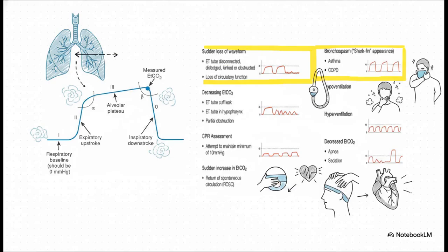Let's apply this to another case study. Your intubated patient suddenly triggers an alarm. By visually deconstructing a normal capnography waveform with its clear expiratory upstroke, alveolar plateau, and inspiratory downstroke, and comparing it to the live data coming in, you become the detective.